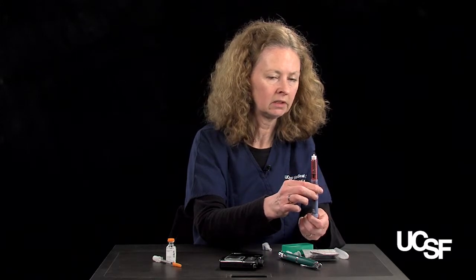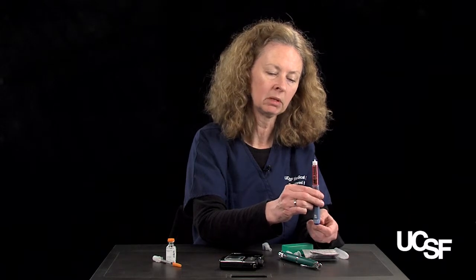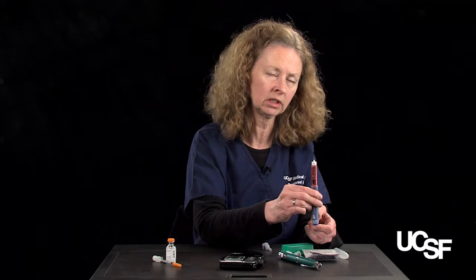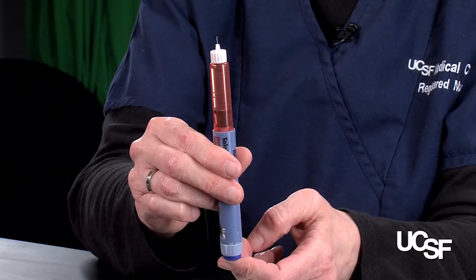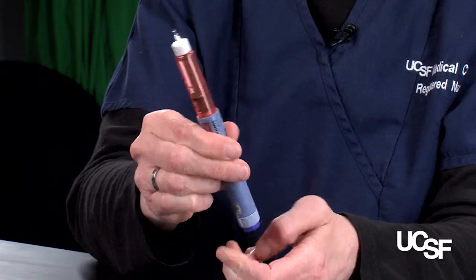to make sure that the pen is working. This is the air shot, 2 units. And now remember that this pen is dialing in 1 unit increments. So each click on this pen is 1 unit. So pushing on the plunger, I want to see those 3 drops, and I do.